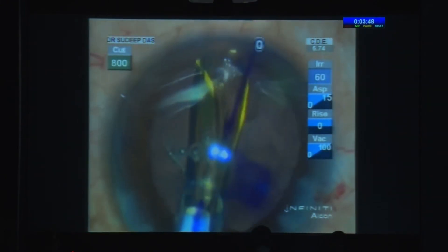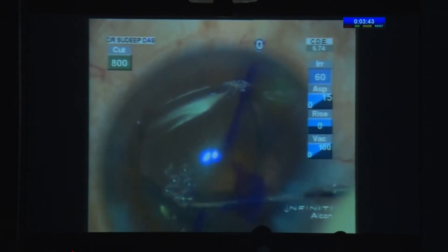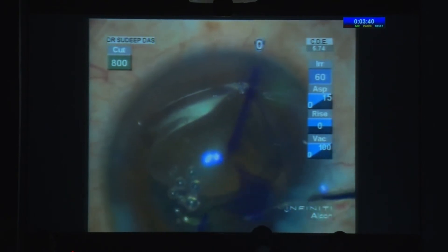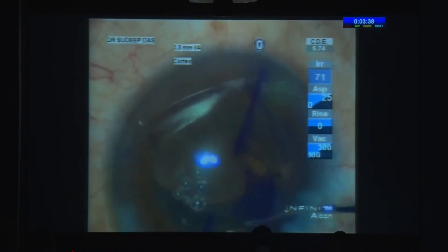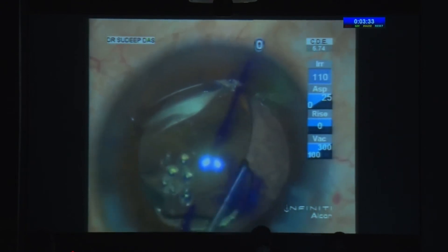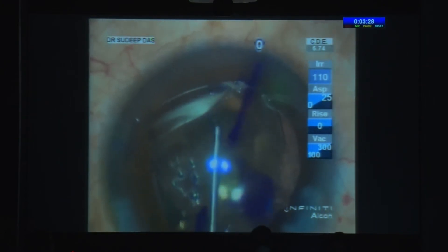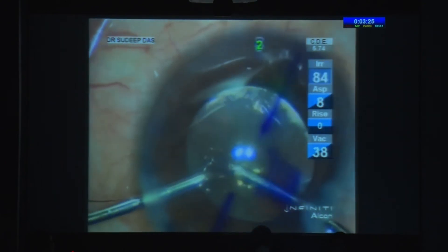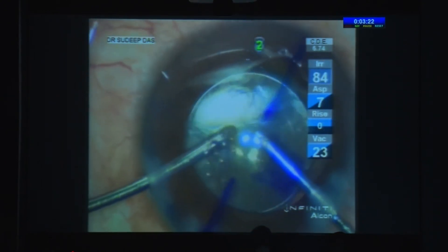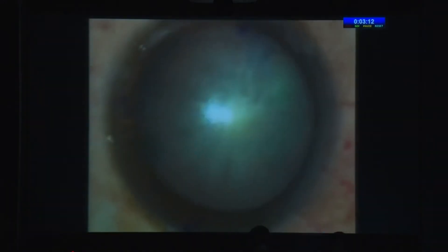After doing a proper vitrectomy, you can actually do your IA — there's absolutely no problem. Then implant the lens. There was sufficient capsule — a large capsule, as you can see on the left side of the screen. This was actually a T9 — the highest astigmatic correction — so I couldn't place it absolutely in axis. It was about 10 degrees off, but in a T9 the patient was still happy because such a large astigmatism had to be corrected.